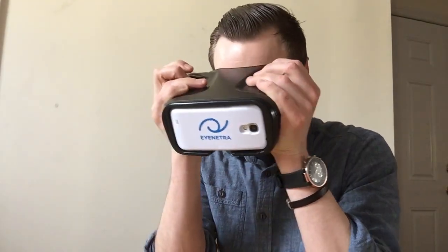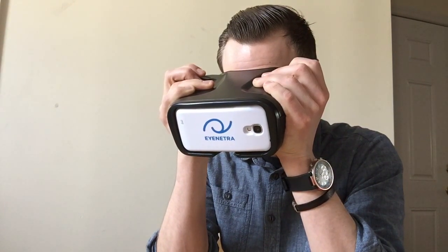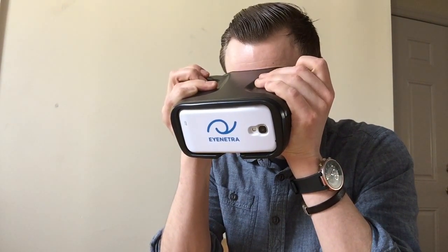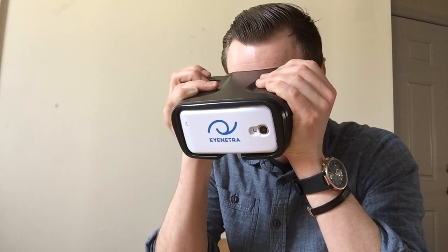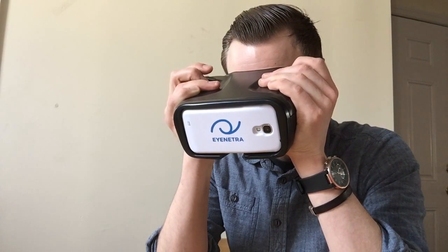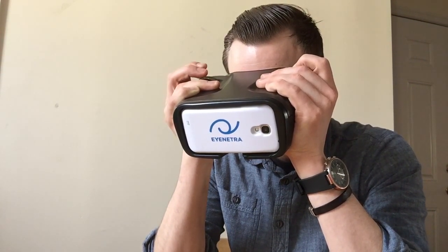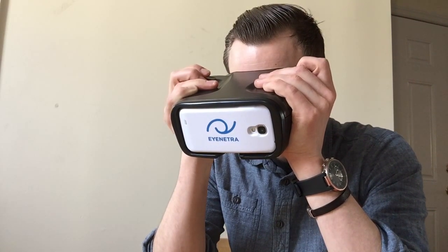Starting with that right knob, I move it back and forth until I see the red and green umbrellas in the center of my vision, equally bright. Then I use the left knob to line up the stems and handles, and click the selection button. The device gives encouragement and feedback as you go. I repeat those same three steps over and over — it's always helpful to remember: right bright, left align, click. The test takes less than three minutes. We're screening for nearsightedness, farsightedness, axis of astigmatism, and PD.